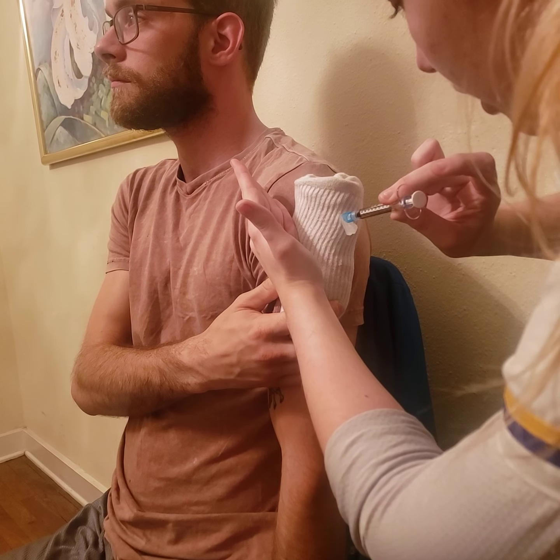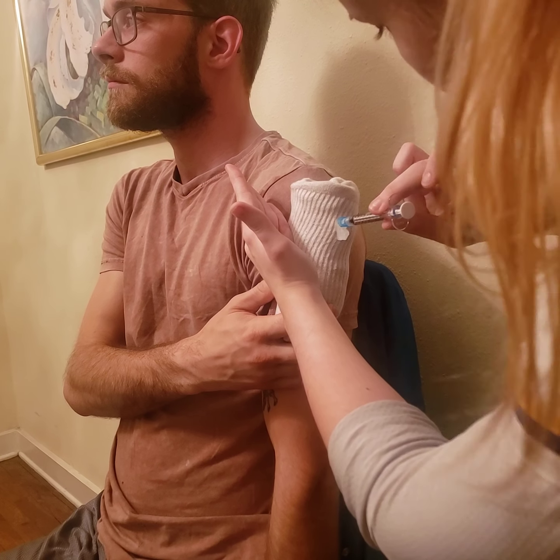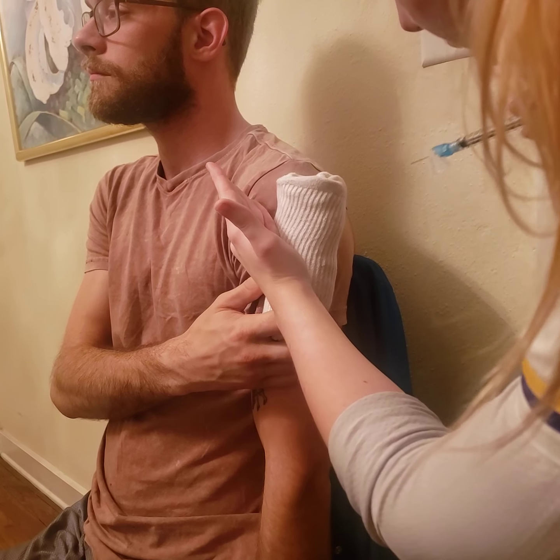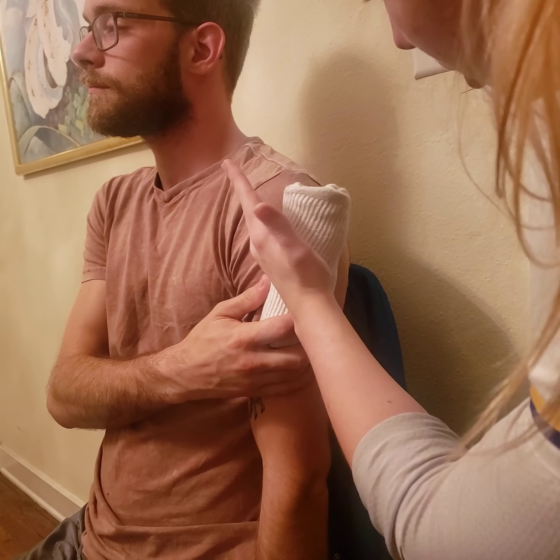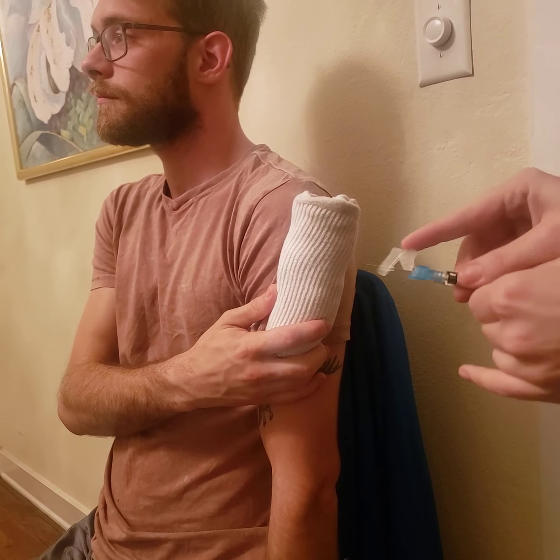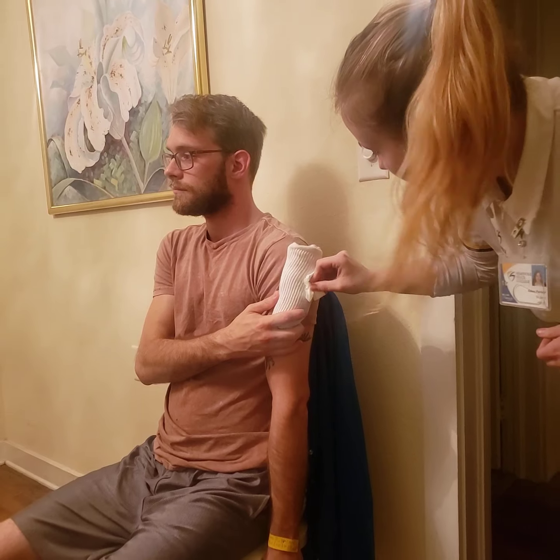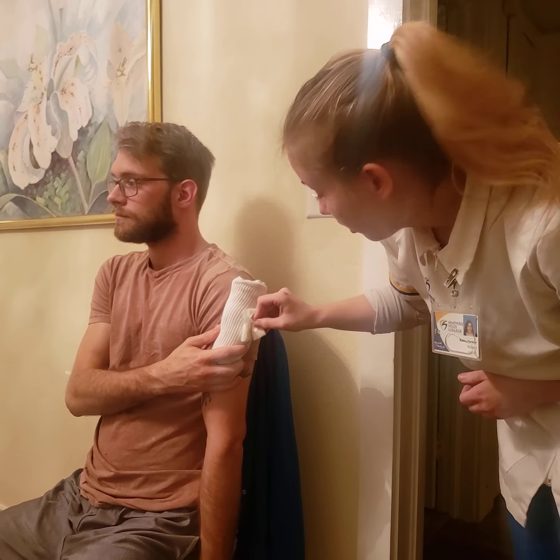Okay, I'm gonna hold it for about 5 to 10 seconds to allow for the muscle to take all the medicine in. I'm gonna remove my needle at the same angle, and then I'm gonna let go of my Z-track, okay? I'm gonna need to cap my needle for safety here, and we're gonna dispose of that in our sharps area. And I would flap Mrs. Pawlowski's arm, not putting too much pressure or massaging. And if need be, I might put a Band-Aid on.